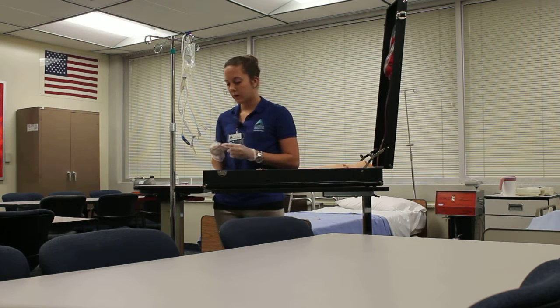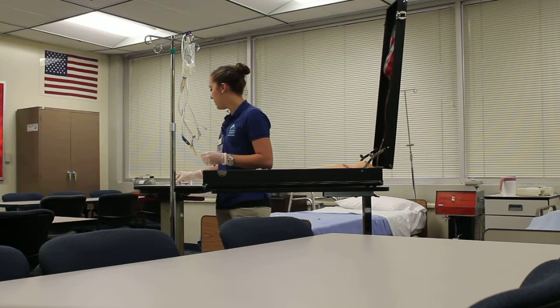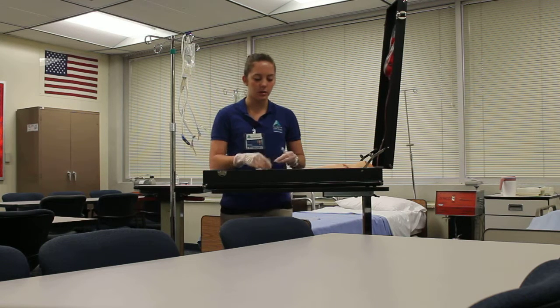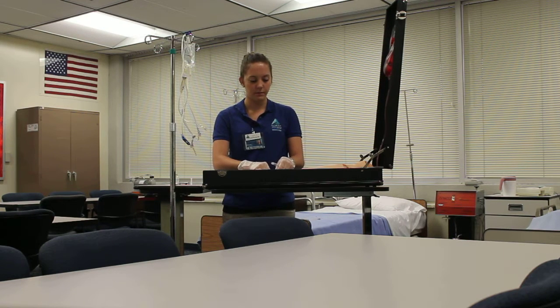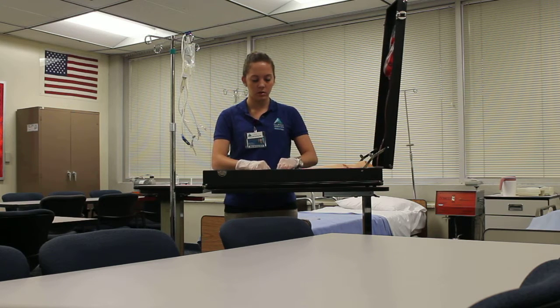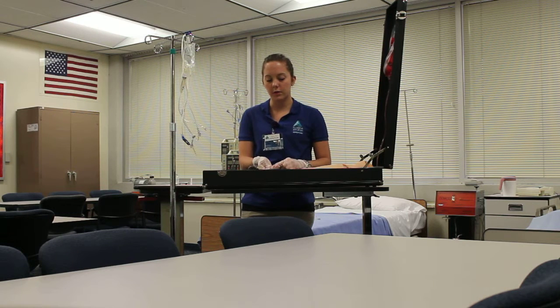I have a 3 ml syringe filled with normal saline. I'm going to swab the top of the syringe as well as the IV tube. I'm going to go ahead and hook up my syringe. And I'm going to use the ASASH method, so I'm going to aspirate and look for blood return. Once I see that, I'm going to use the push-stop method.